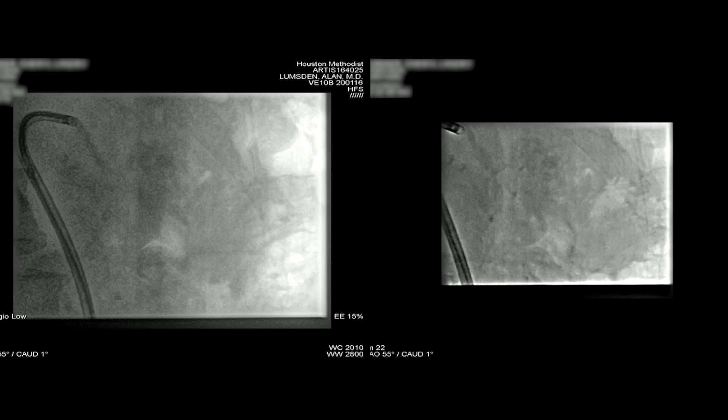At this point the patient was awake and really was having a hard time holding her breath so we could get good shots. So we made the decision to put her to sleep and go ahead and create Image Fusion. Image Fusion is done in this case by bi-planar fusion — we take two views, ideally about 90 degrees apart. That allows us to import the CT scan.